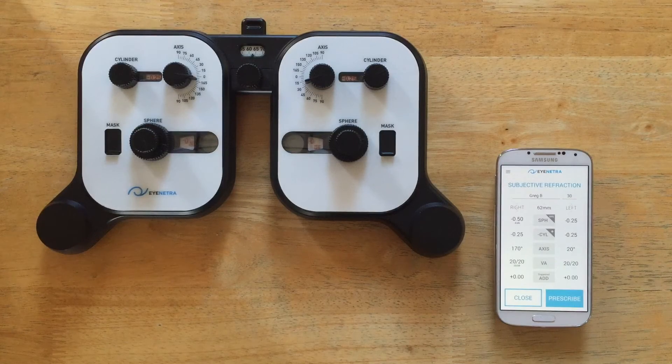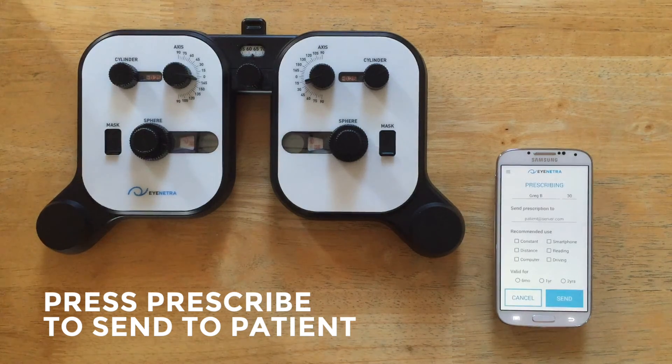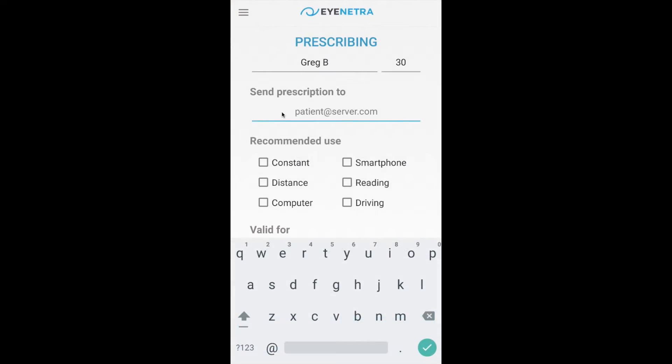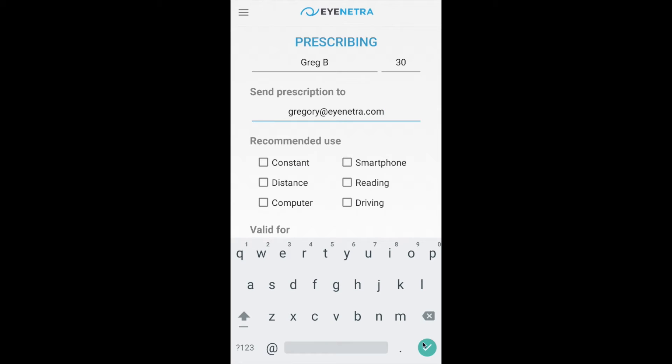Now to send the prescription directly from your iNetra phone simply press prescribe. Enter the patient's email address and enter in the recommended use.